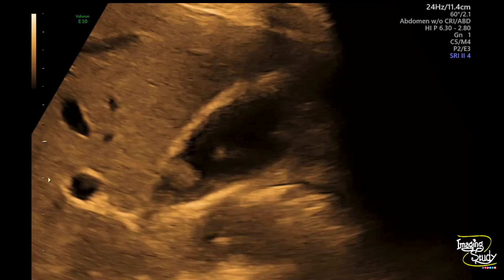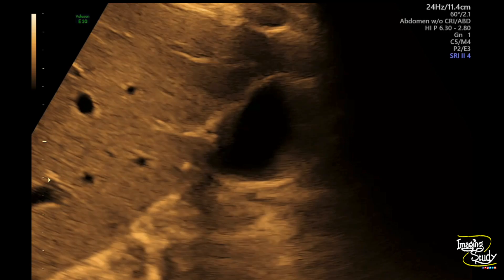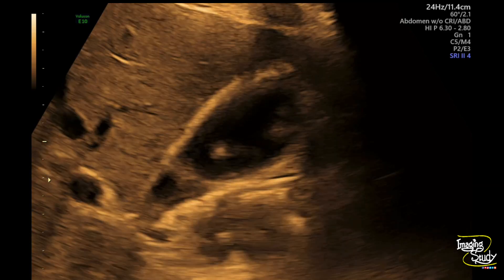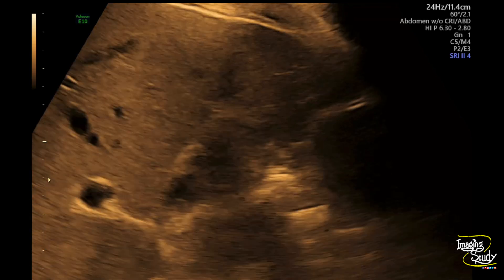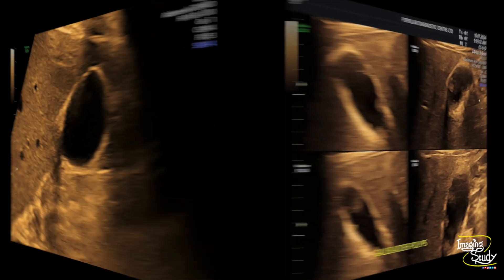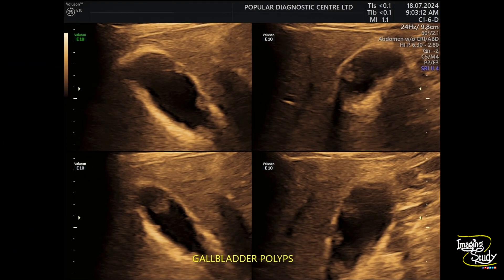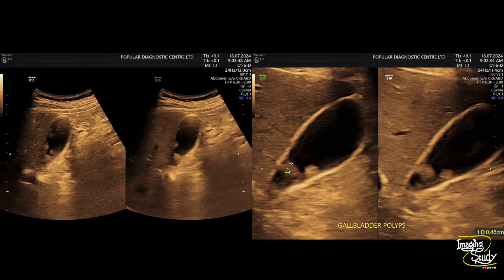We have changed the posture of this patient and there was no change in position of these polyps. Here you can see multiple polyps arising from different parts of the wall and protruding into the lumen without any posterior acoustic shadow. The largest one measures around 5mm.